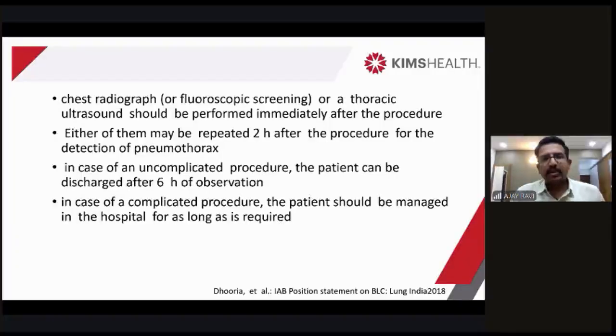If the patient has any complications like bleeding or pneumothorax, you may have to deal with an ICD. In bleeding, you may have to deal with it on the table itself and get hemostasis. Then only you can stop the procedure. So that is the basic procedure.